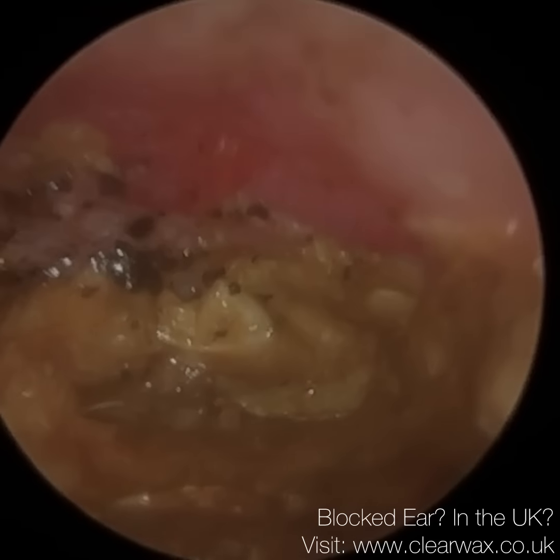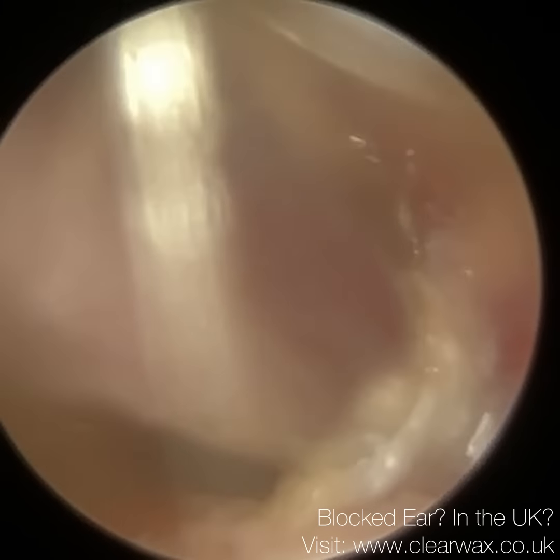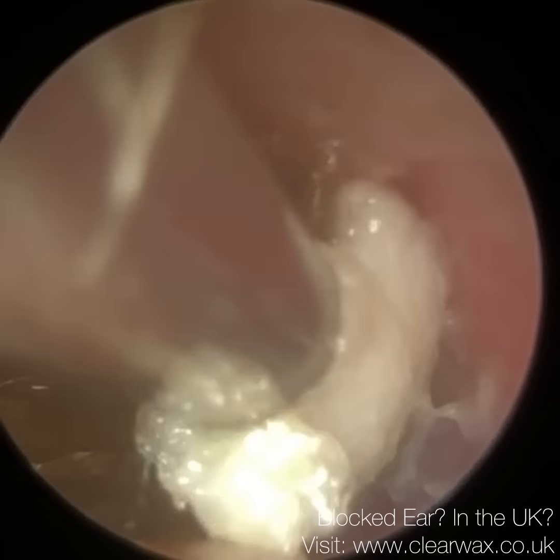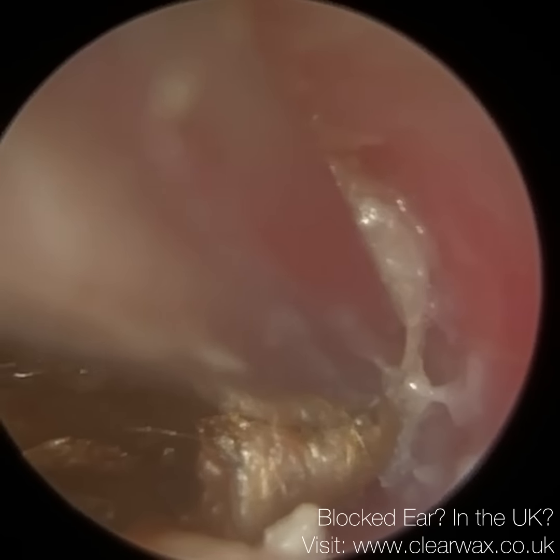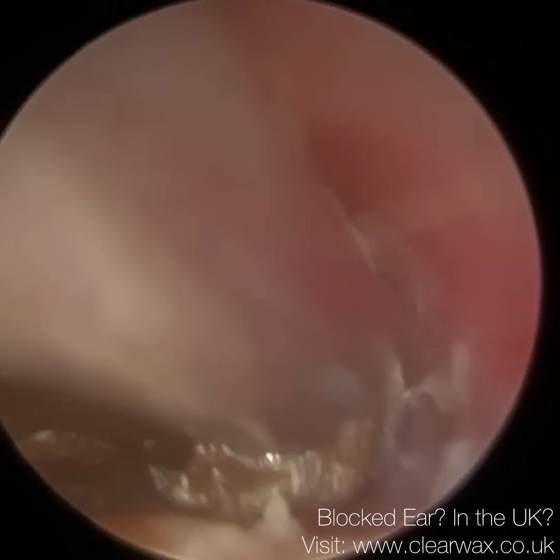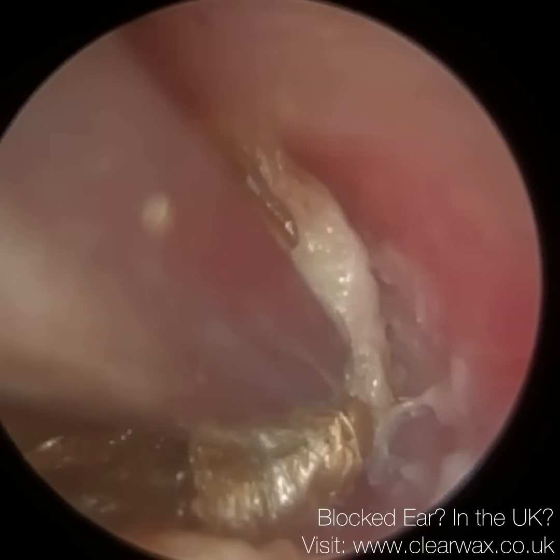I try and remove as much of the fungal spores as possible, but this patient's ear canal is quite angry. You can see how it's red in this region, so I had to stop because it's getting slightly uncomfortable for the patient. So they're going to use some antifungal drops, which should just finish off the job.